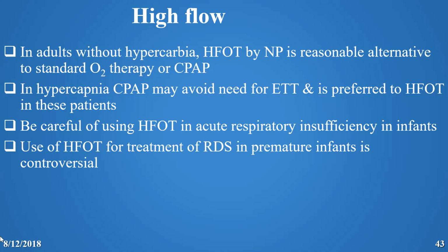Use of high flow nasal cannula is not advisable in premature babies less than 35 weeks, but some are using it. So it's a little bit controversial.